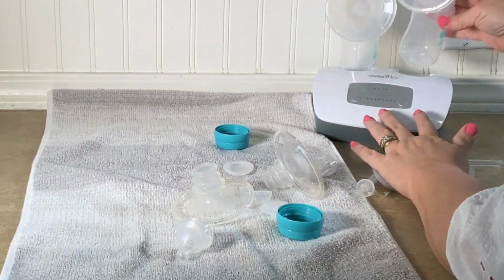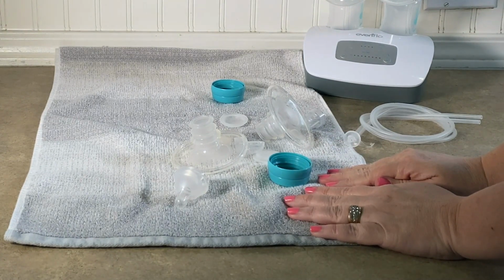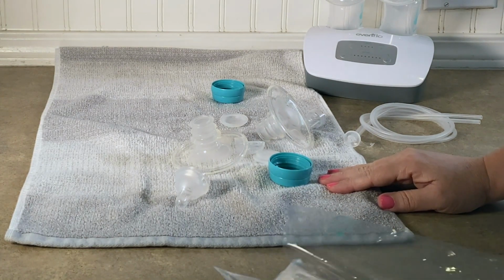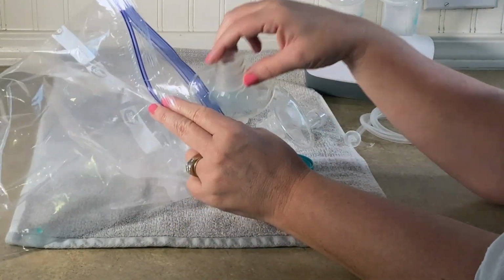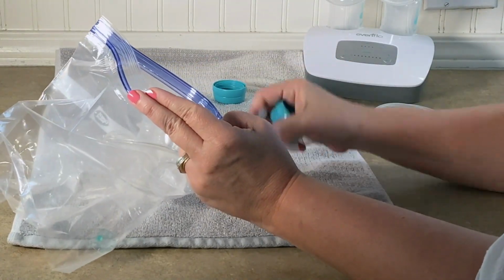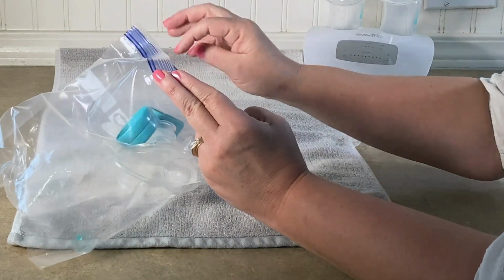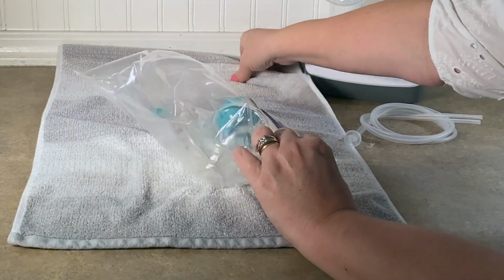Okay, now you notice I have some pieces left. These are the other pieces that were in the box when we unboxed the pump. I find it's best to go ahead and put these pieces into a zippered pouch, or you could put them into a box with a lid. You just want to make sure that they're covered and sealed, and that way you can remember that they're ready to use. They're going to stay clean until you need them.